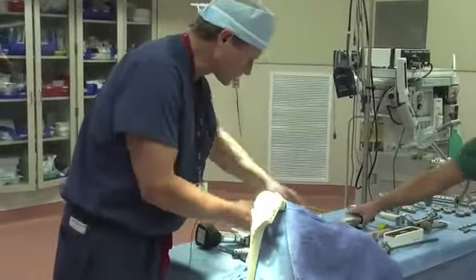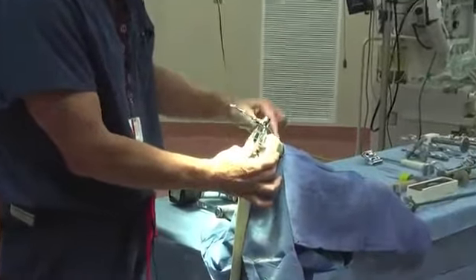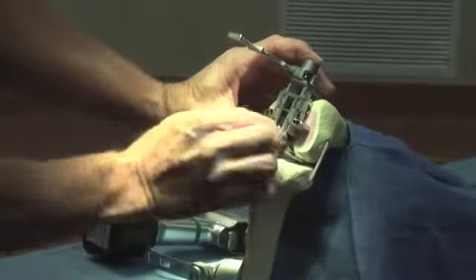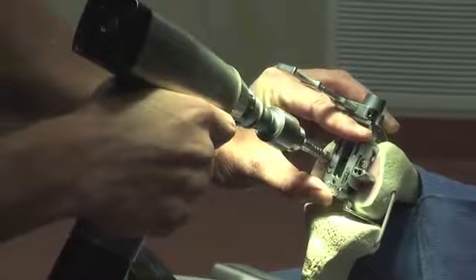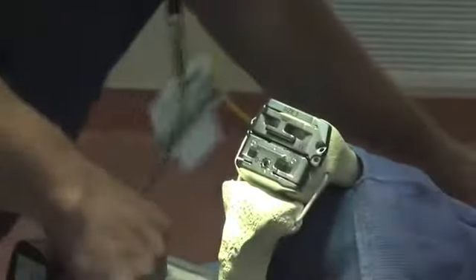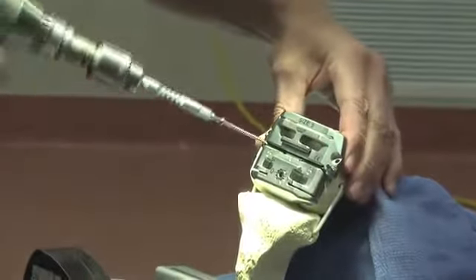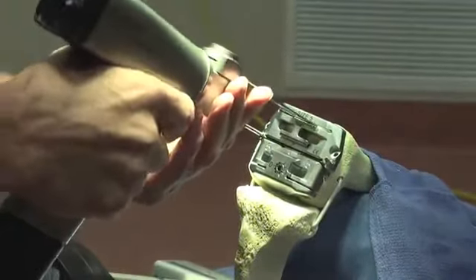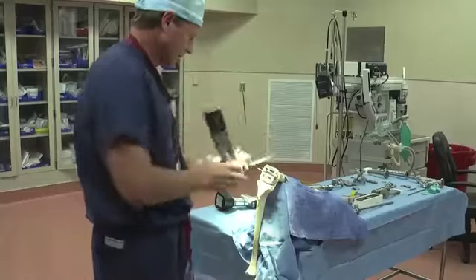We're going to use a sizing guide to figure out what size femur we want to use. We'll put the feet down up against underneath the bone, place the block up on there, and use this little stylus on top of the bone to make our decision. We'll read it off of this area right here, put little drill pins into this guide, and then put on our cutting block. Next we'll pin that in place to keep it good and stable. This block will make our front and back cuts, and what we call our chamfer cuts. We'll start on the top here, then make our chamfer cuts, and then come up and make this top chamfer cut.